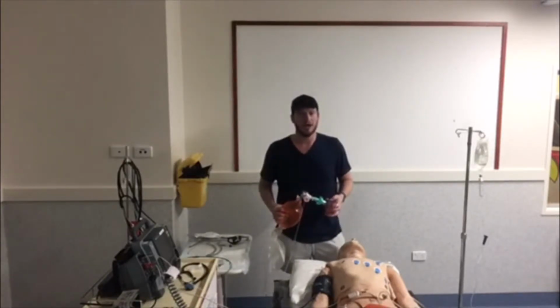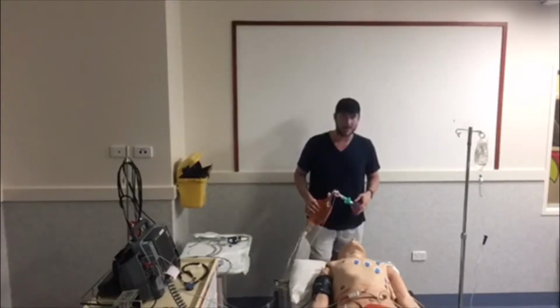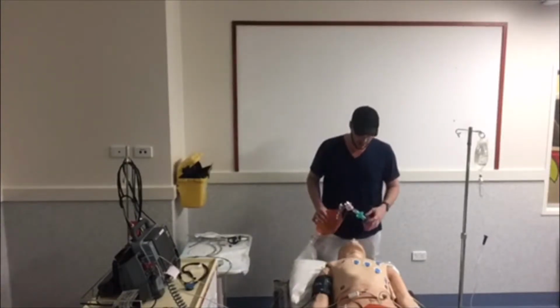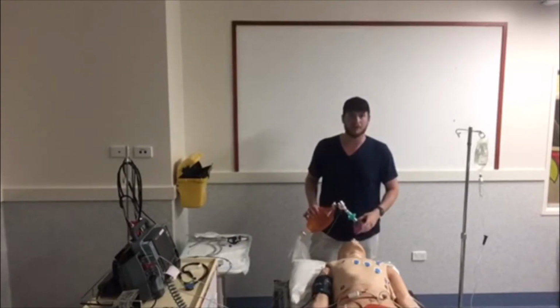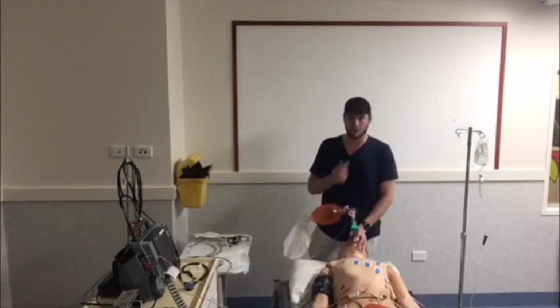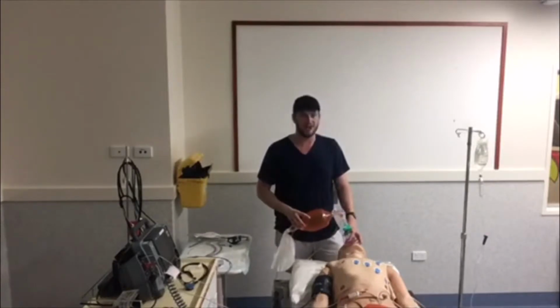as well. So at the moment we've got an unconscious patient, currently has nasal prongs at high flow oxygen on, and currently has an oropharyngeal airway as well. Patient's being pre-oxygenated at the moment, so we've got two oxygen sources, one for the nasal prongs and one for the bag valve mask as well, pretty important. While we're doing this, we're assigning roles as well, making sure everyone knows what they're doing.